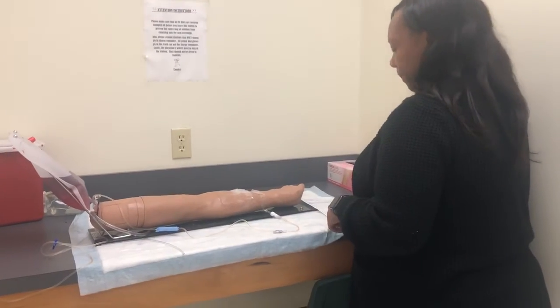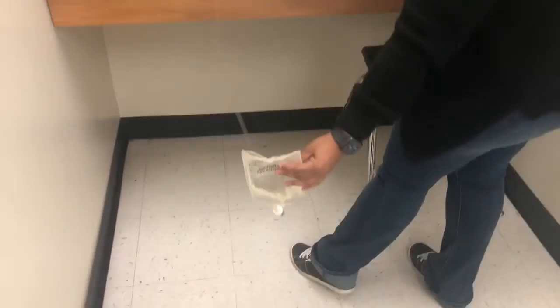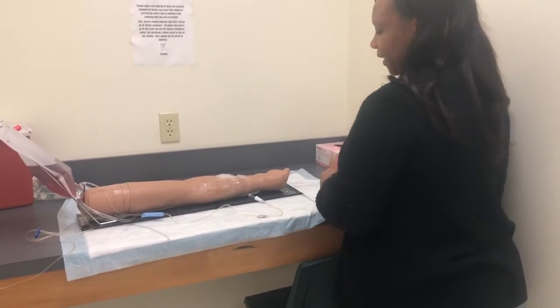So at this time, I lower my bag. Make sure I have blood return. I do have blood return. I'm looking for any infiltration, warmness, everything is fine. No infiltration, no warmness noted.